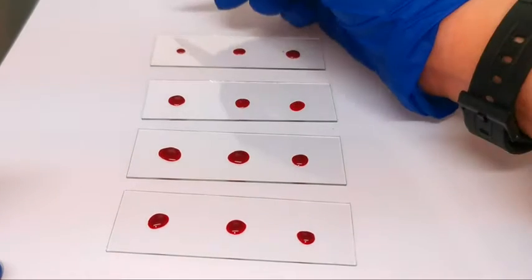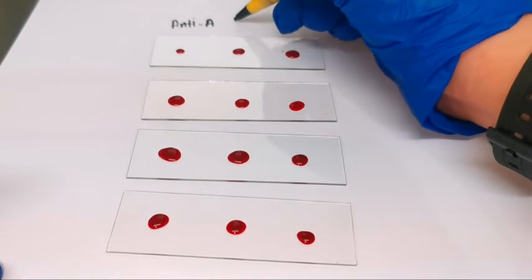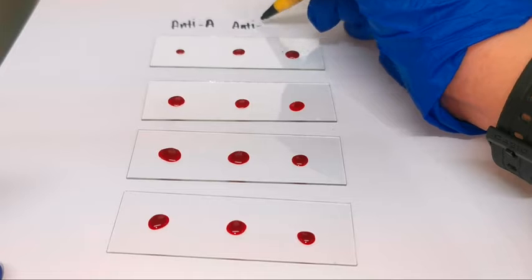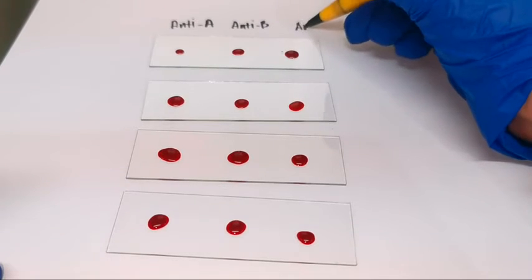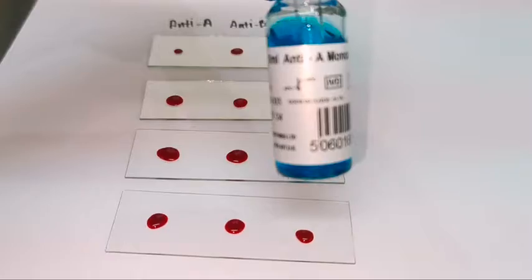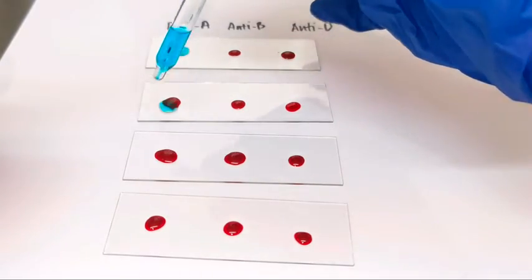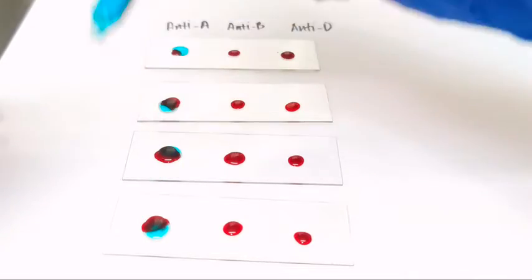Label the first column anti-A, the second column as anti-B. Lastly, label the third column as anti-D. Then put 1 drop of anti-A antisera on the first column.